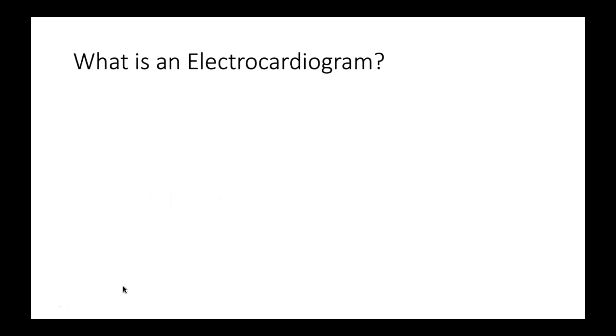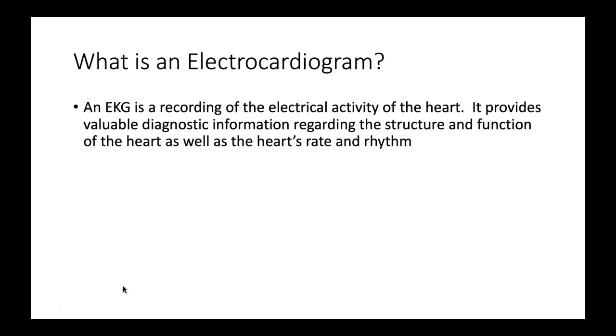What is an actual electrocardiogram? Well, an electrocardiogram is a very common diagnostic tool that we use to record the electrical activity of the heart. It gives us important information about what is going on with the structure, the function, as well as the rate and the rhythm.